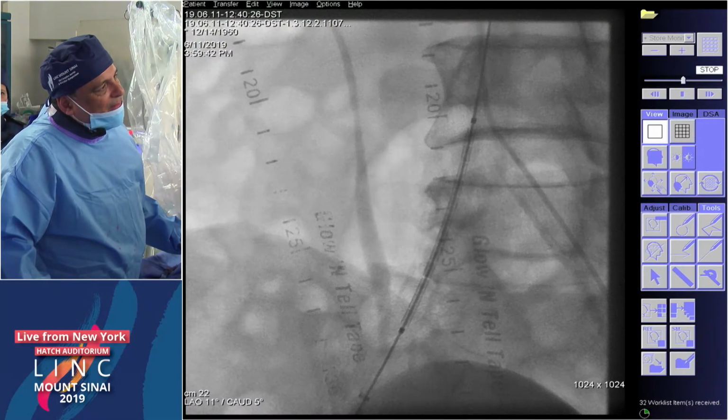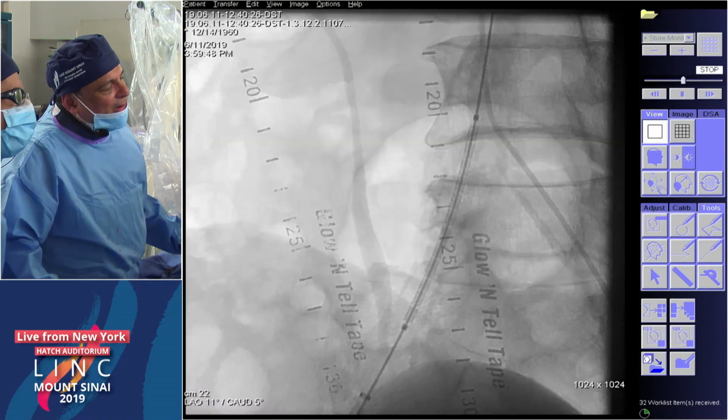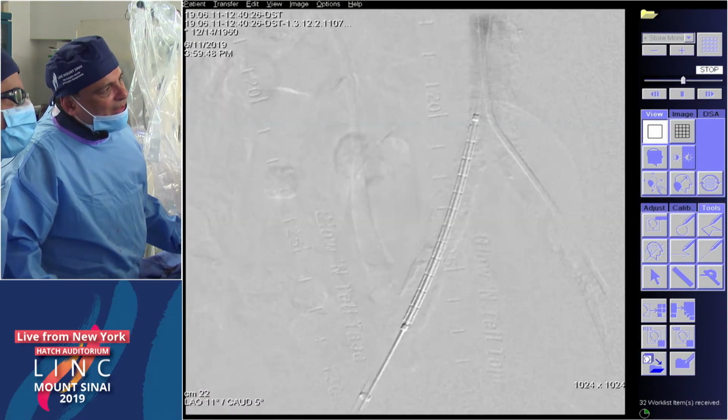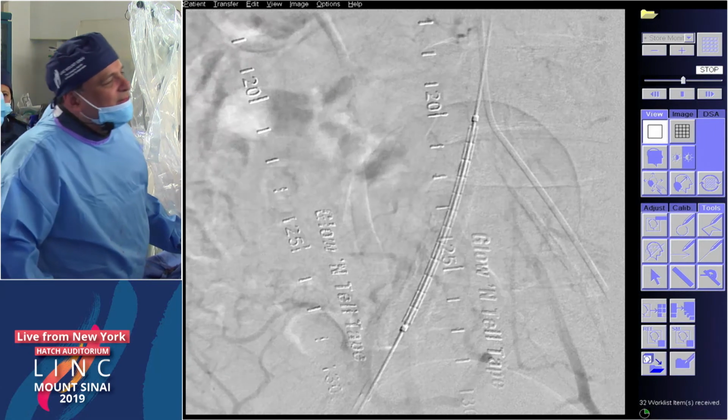I think I agree with Anvar, maybe a little overkill here. And I'm just going to go ahead and hit it. And I think for the audience, this is the thought process we all share. Are you guys okay there? You would come back more.